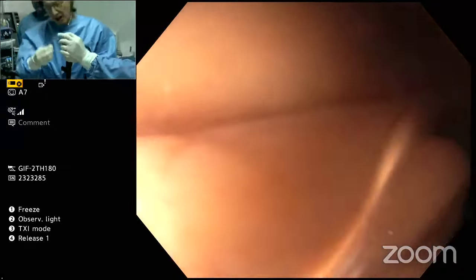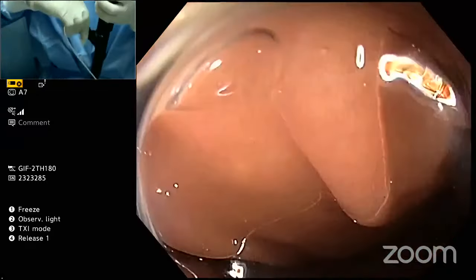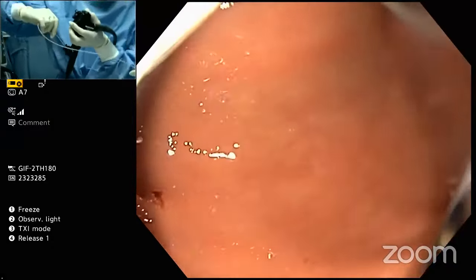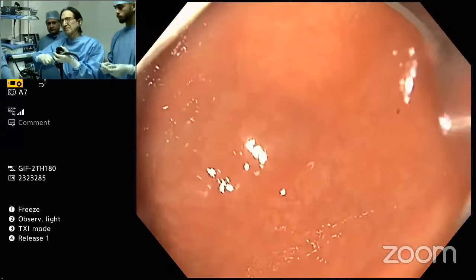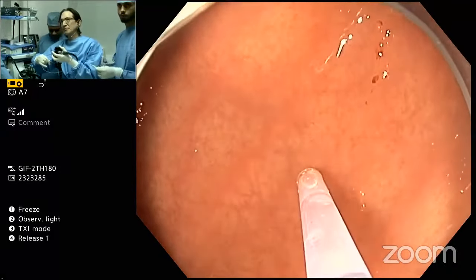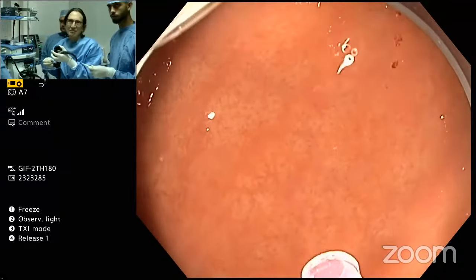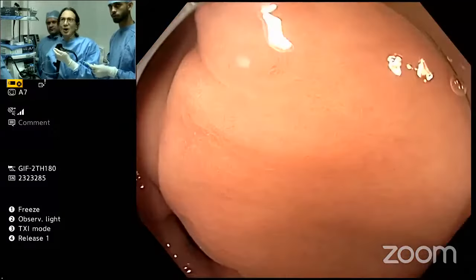All right, so now we're going to go through our bigger channel here. Okay. So now you pretend this is a single channel scope. It needs to be a therapeutic scope, of course. You don't want to be doing this with a diagnostic scope, like the 1T. And so here's our helix. There it is. You can see inside the helix is at the very tip. You see it there? The coil? It's just a helix. Nothing fancy. Very simple. Simplicity is always a virtue.